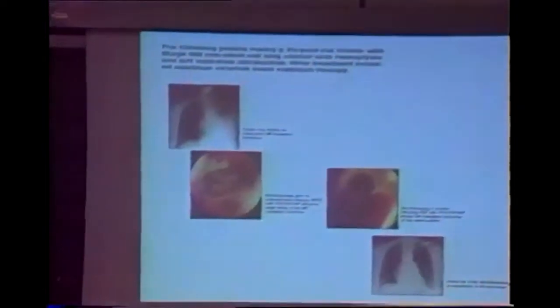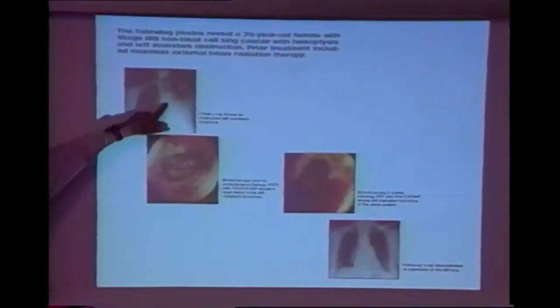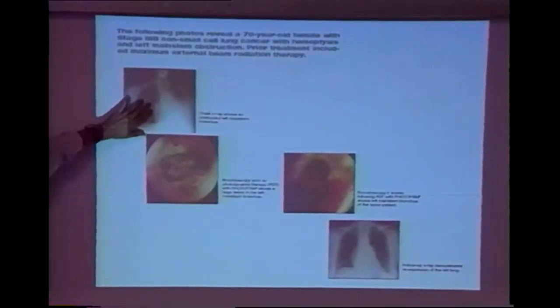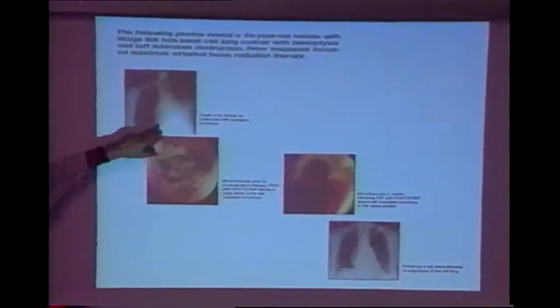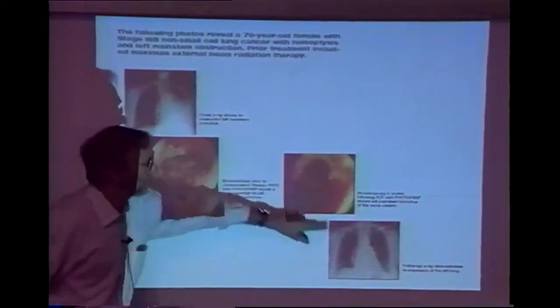Here's an example in late-stage lung cancer. So here's a patient with an obstructing tumor in one of the lobes of the lung. You see on the X-ray, there's air here, and this is completely obstructed, so there's no air going into this lobe of the lung. Optical fiber, treat, produce necrosis, go in, take out the necrotic tissue, and you basically open it up.